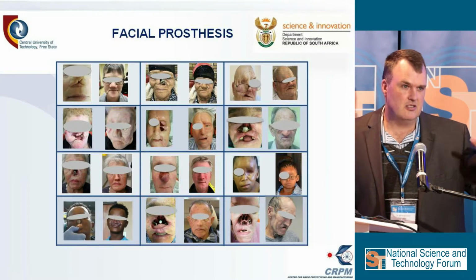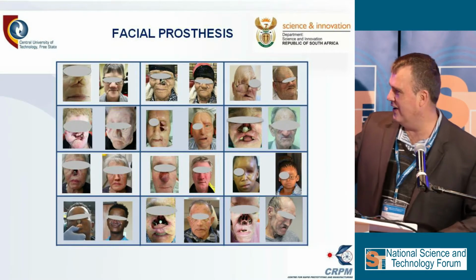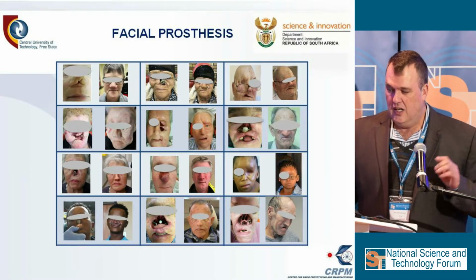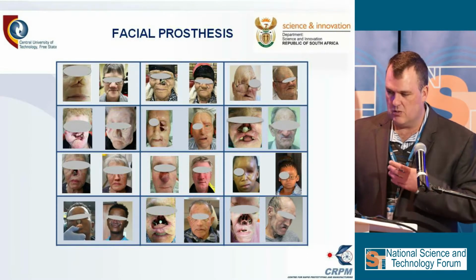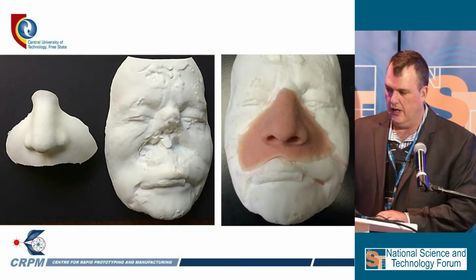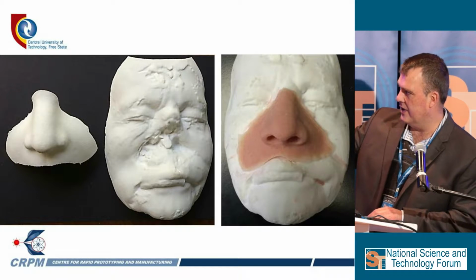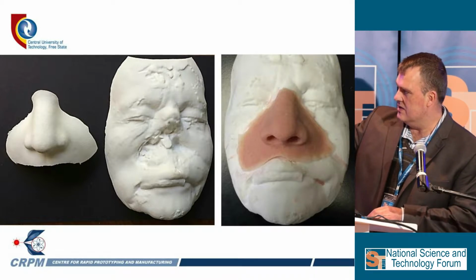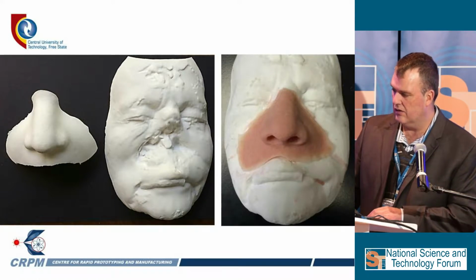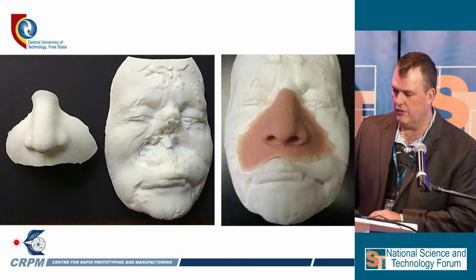I think it's good that this screen is going on and off, but this was the gentleman that I showed the first video of. We 3D printed left, right. That was his nose prosthesis, and then the right side is the clip-on face.